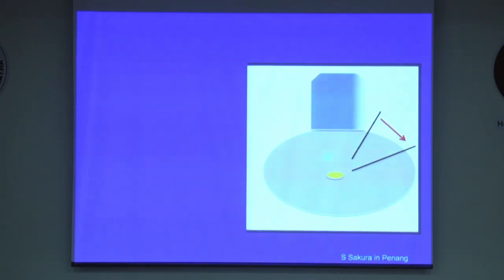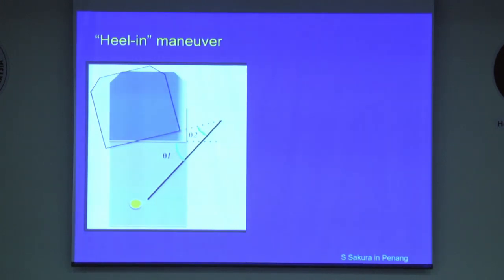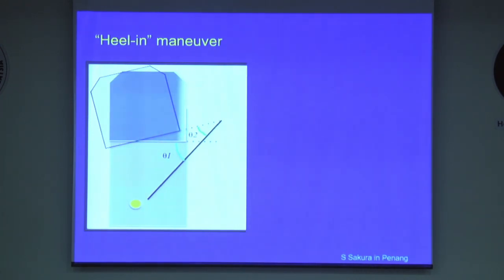We insert a needle as far away from the transducer as the needle length will allow. Finally, there is a technique called the heeling maneuver — press the further edge of the transducer into the skin while lifting the nearest edge. This has the effect of making a less obtuse needle angle relative to the transducer, which can improve visibility.